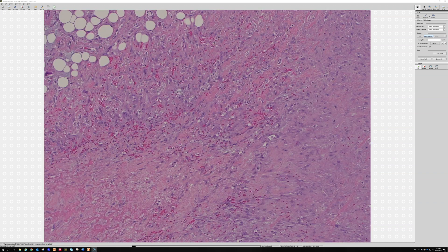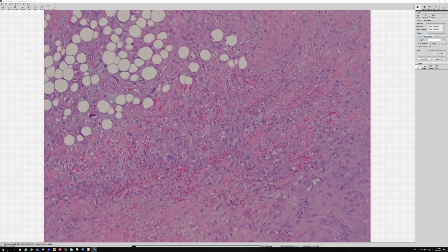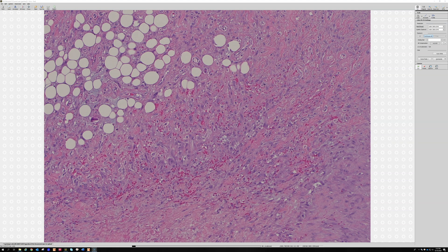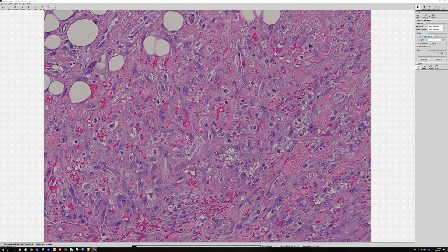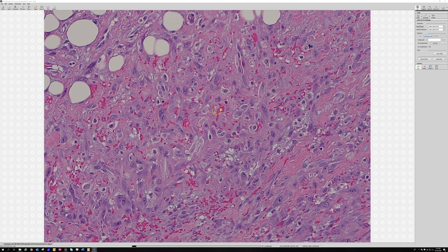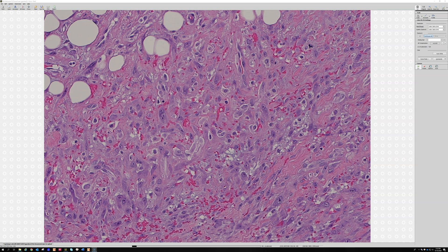Also, if you do CD34, usually much of the lesion — except for the vessels — will be CD34 negative most of the time. These areas look really scary, but there are ganglion-like cells intermingled with really juicy revved-up endothelial cells that are starting to make new vessels, just like vessels in really robust granulation tissue.